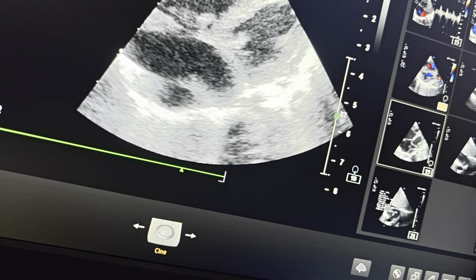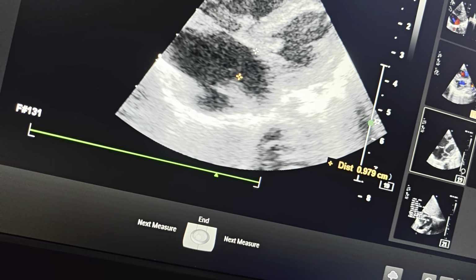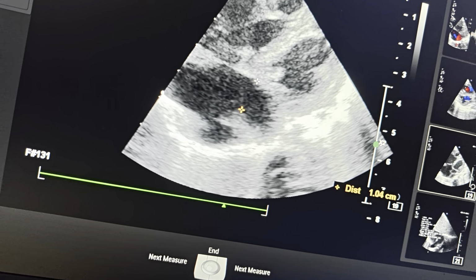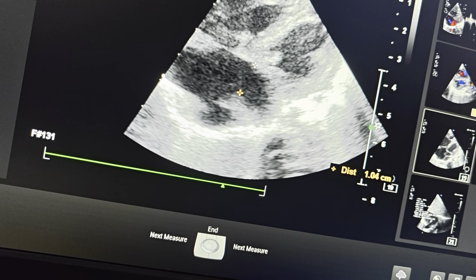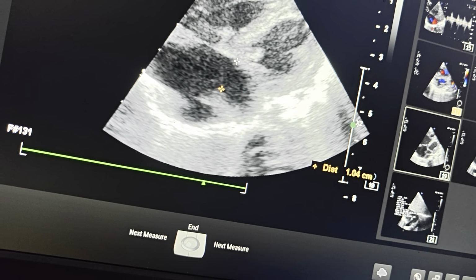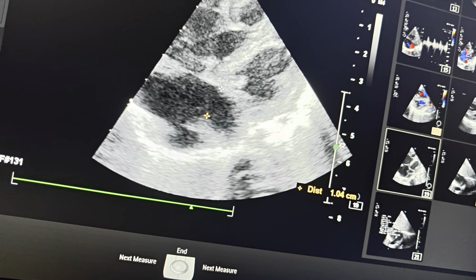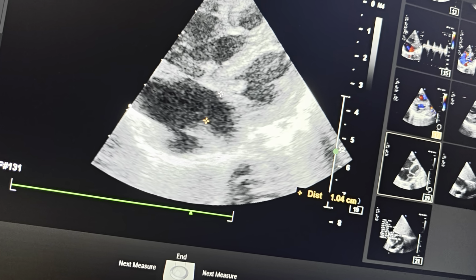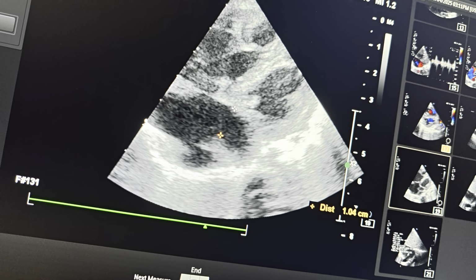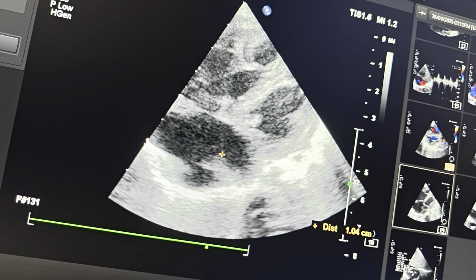You see, this is coronary sinus. This whole length is coronary sinus, almost 10 millimeter. So dilated coronary sinus, all pulmonary venous confluence joins coronary sinus. Right atrium, right ventricle large, oxygen saturation is poor. The case is total anomalous pulmonary venous connection through coronary sinus, and mixing happens through ostium secundum ASD and patent ductus arteriosus. That is responsible for mixing.